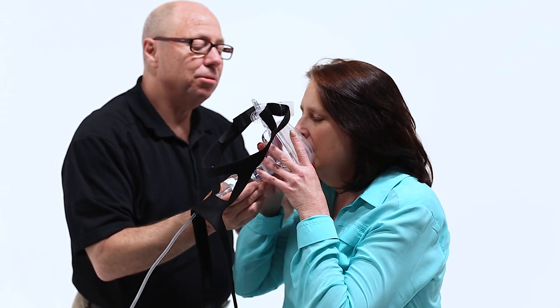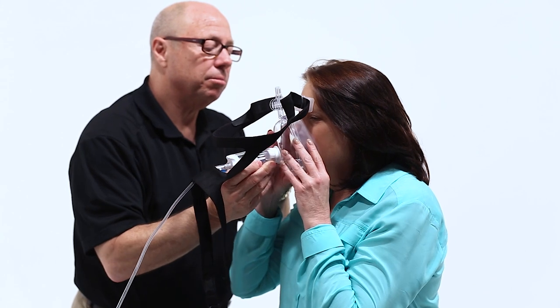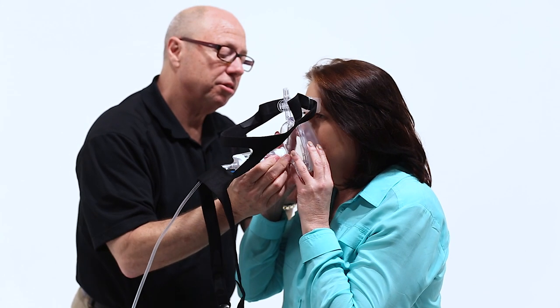We would recommend giving your patient time to adjust. Have them hold the mask to their own face. This allows them to ease their anxiety and to feel the oxygen at their face.